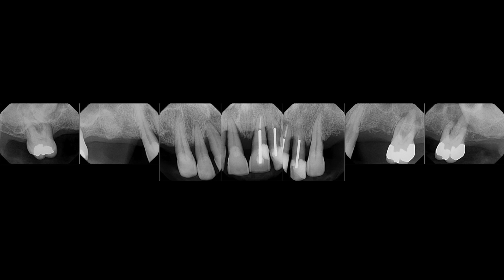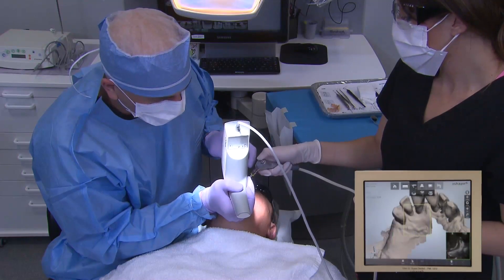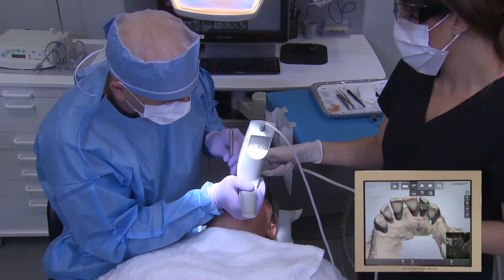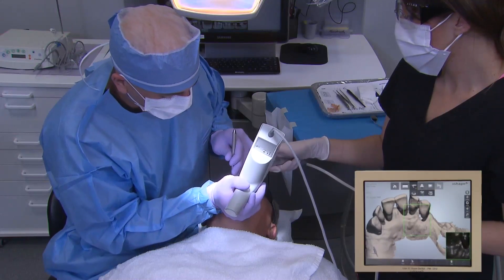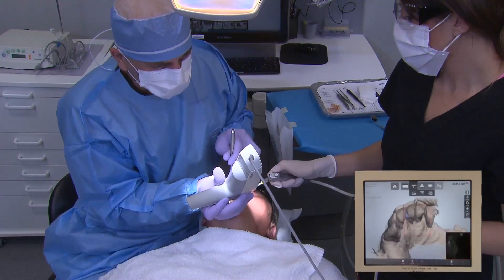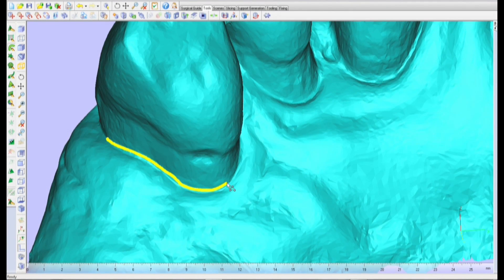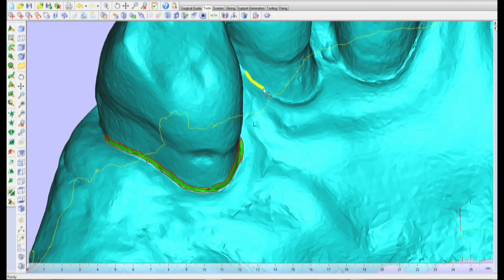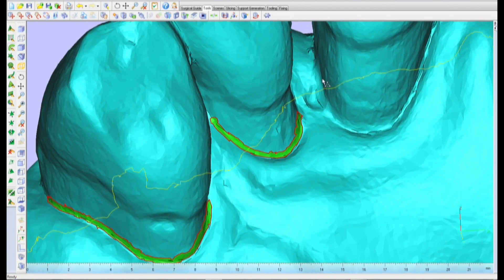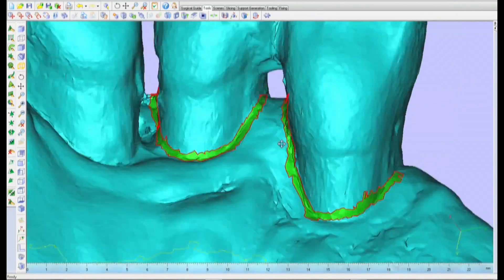At the initial visit, we collected a lot of information. Part of that data collection is a full mouth intraoral scan, where we capture all the hard tissue. We're able to merge that information with the cone beam CT scan, and that way we can fabricate our surgical guide for the patient to receive implants. This case involves extraction of all the teeth in the maxillary arch, along with placement of immediate implants and immediate loading.